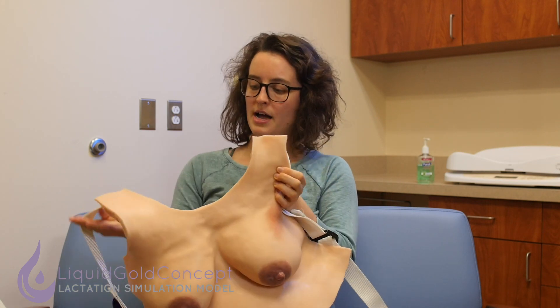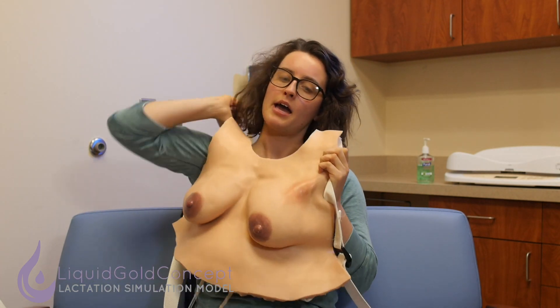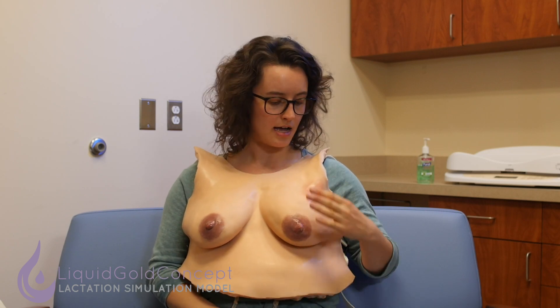Have your patient put it on, and this time when you do the breast exam you're going to notice that your patient — a two-week postpartum mom who's had a very complicated pregnancy and breastfeeding journey so far — has some red discoloration of the breast tissue.